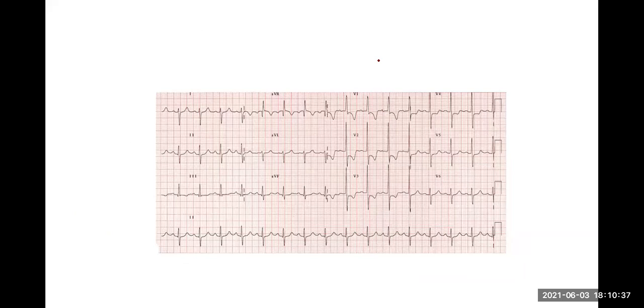Okay, fine. Now, the ST segment can also be depressed. So you can see here ST depression. So ST elevation, ST depression. Remember that ST depression can occur due to ischemia. That is usually horizontal or downsloping. Upsloping ST depression, where the ST depression is like that, is not a feature of ischemia. So if somebody asks you, ST depressions, horizontal and downsloping, are suggestive of ischemia.